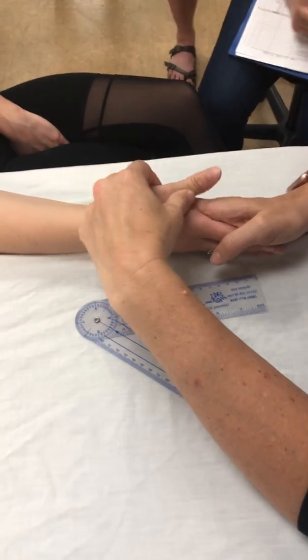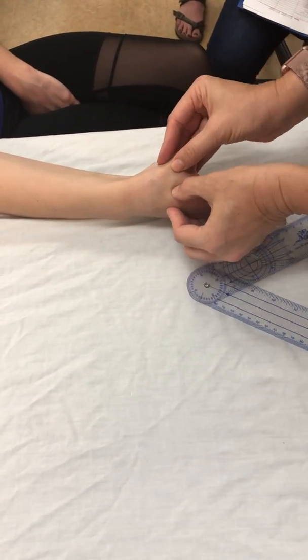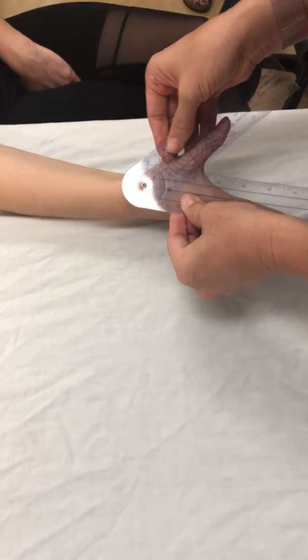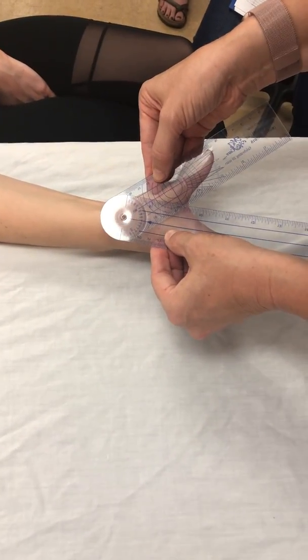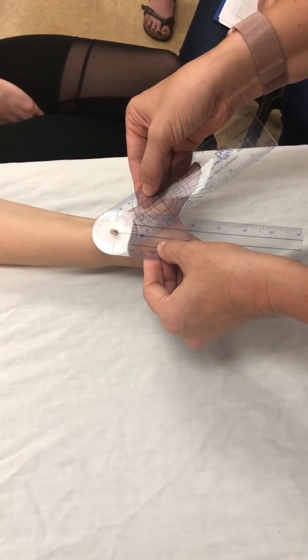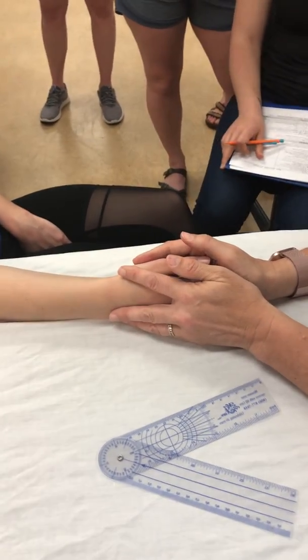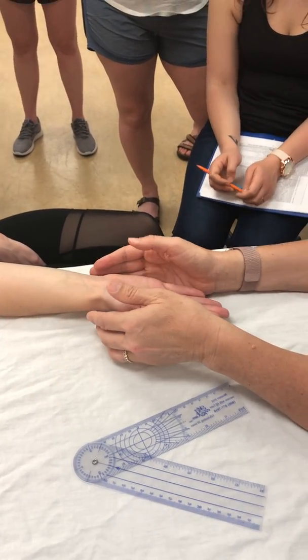So let's go ahead and have you go all the way up. There you go. With the hand, you have to be really careful that you're not getting manipulated by those thenar eminences, and that you're really cutting along the metacarpals. Okay, so Christine has 10, 20, 30, 42 degrees of CMC abduction, active range of motion on her right. Are you comfortable like that?